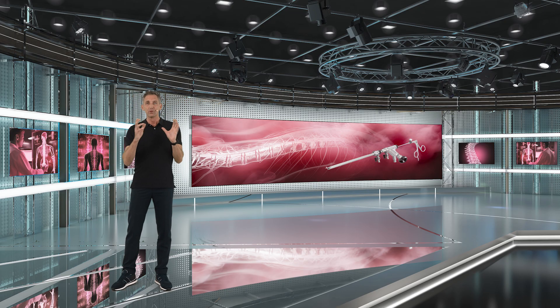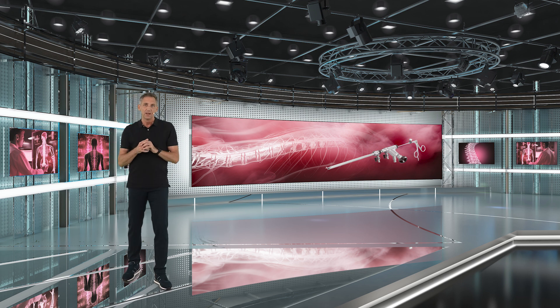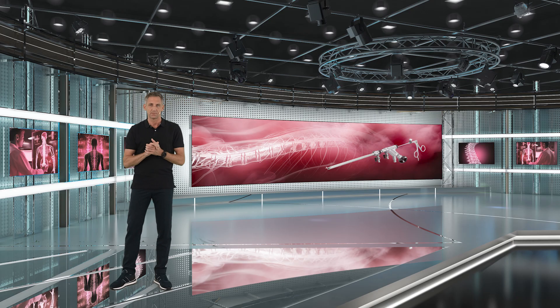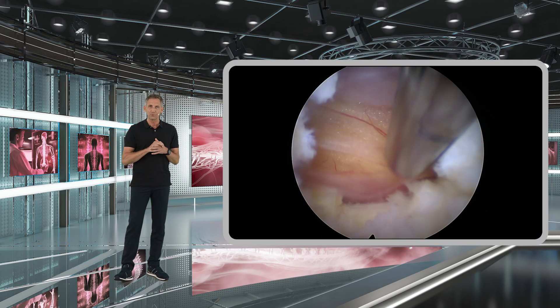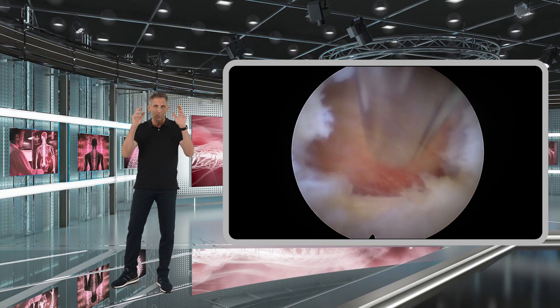It is important that you have a full anatomic orientation of the dura, the nerve, and the recess, and that you can clearly see all neural structures at all times. For this purpose, I recommend that you remove these soft tissues, which almost look like spider webs.